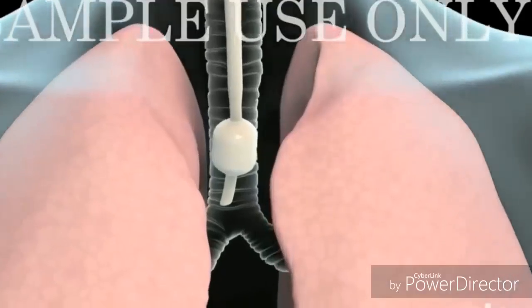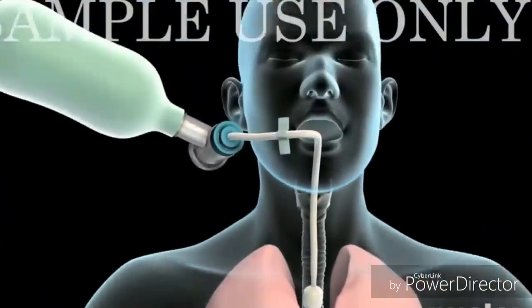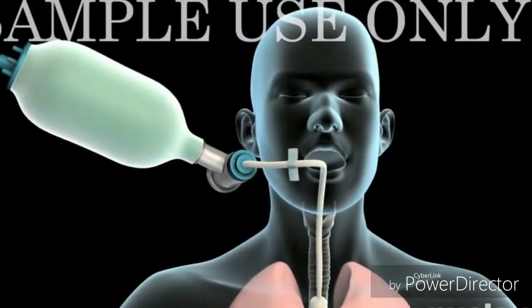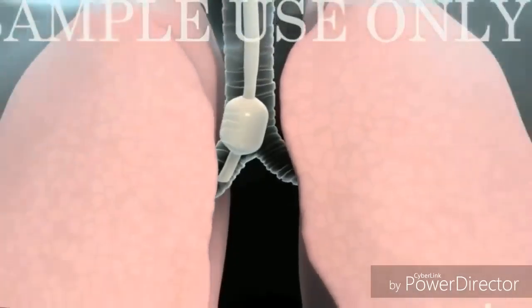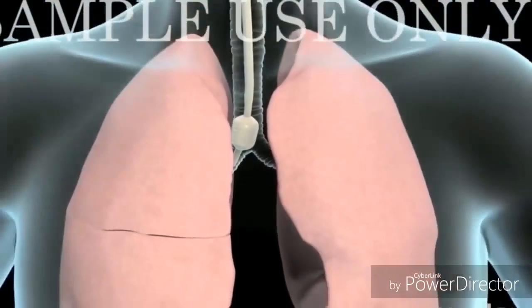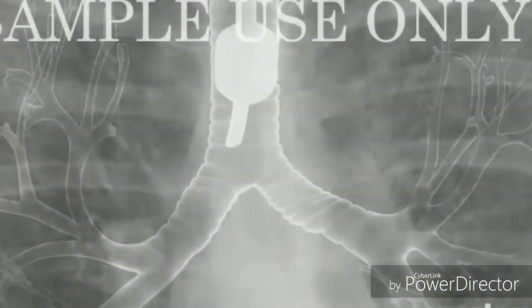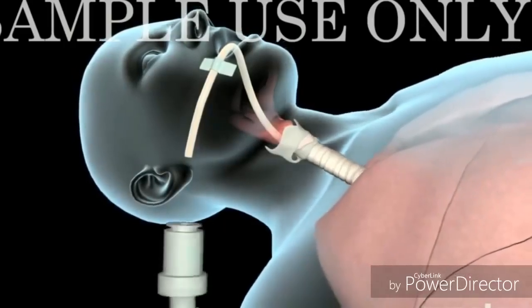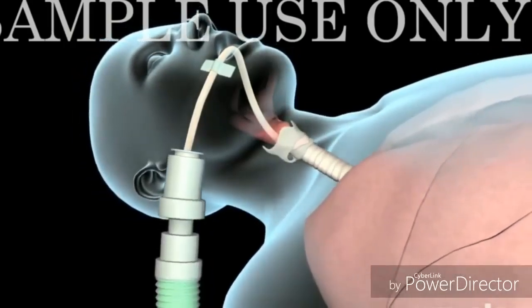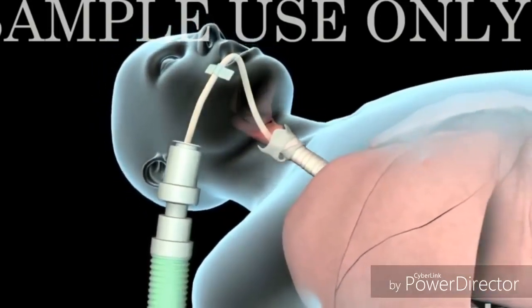After fixing the endotracheal tube, the air entry in both the lungs is checked with the help of the ambu bag. With the help of the ambu bag, the expansion of the lung on both sides is observed. Sometimes there is a possibility that the endotracheal tube may inflate one lung and the other lung remains as it is. In that condition, you can take a chest X-ray to look whether the endotracheal tube is placed in situ or not. Now, finally, after removing the ambu bag, you are supposed to attach the endotracheal tube to the ventilator. This is how the process of intubation is done.